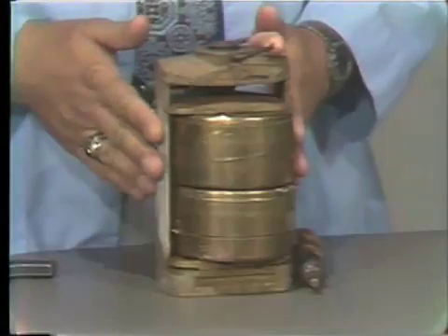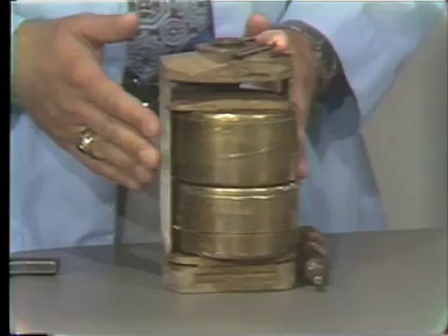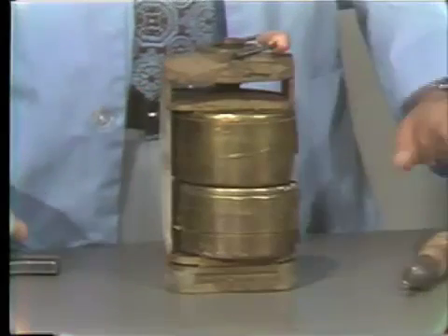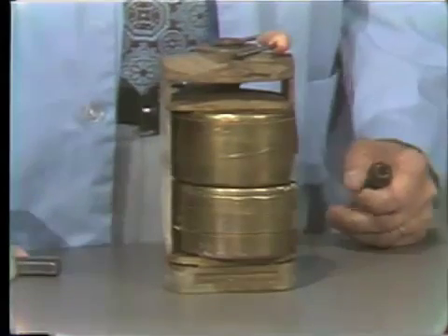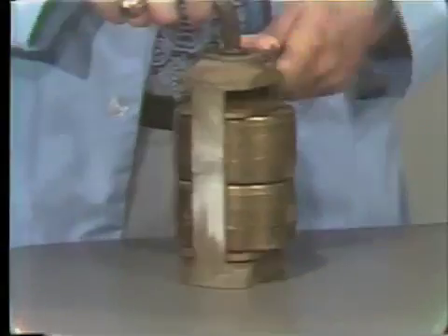I have already removed this from the water and let it cool down to room temperature, and it's important to do this. If you were to remove the denture while it was still quite warm, you could distort the dentures. So to begin with, we'll remove the flask from the flask press.